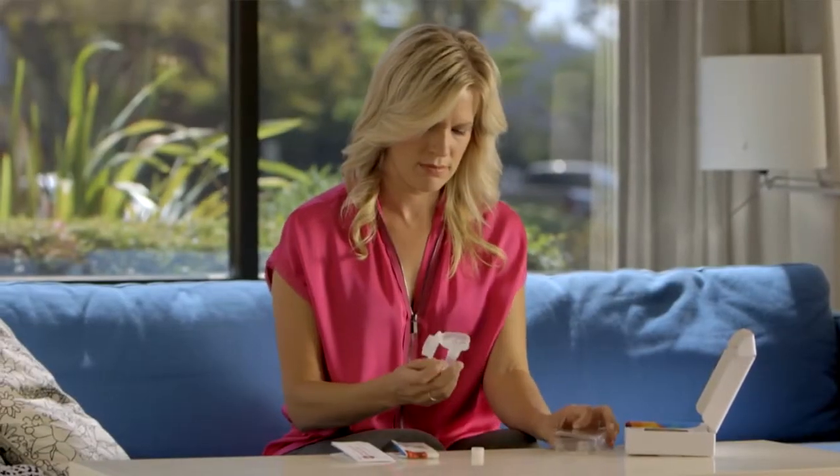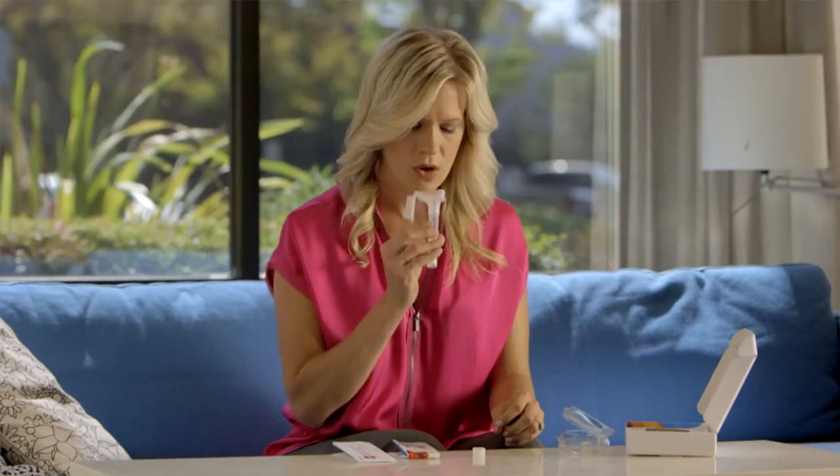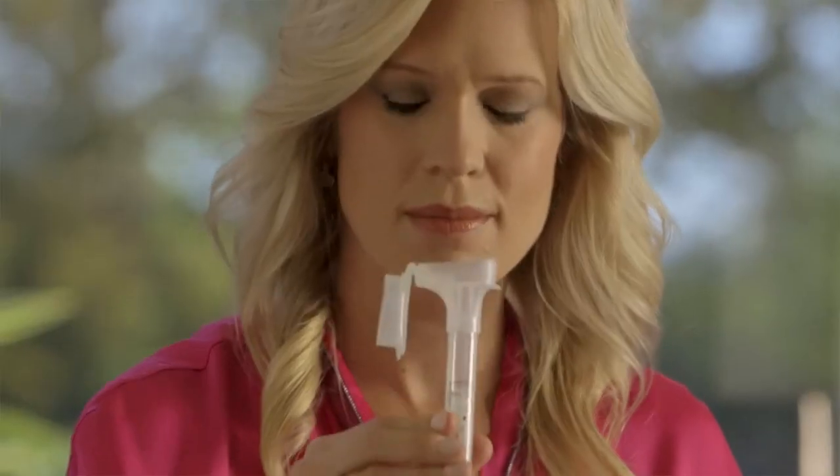Next, make sure you provide the recommended volume of saliva. You will see the words "fill to" on the side of the tube and you'll need to provide enough saliva to reach that line. The saliva needs to be liquid, not bubbles.